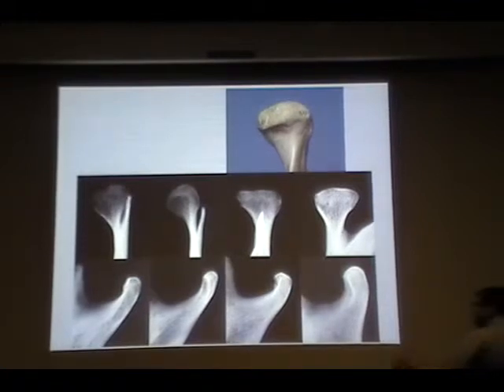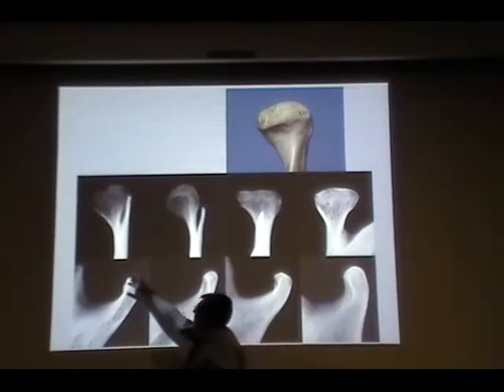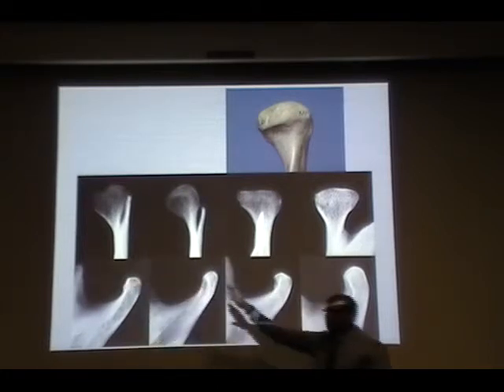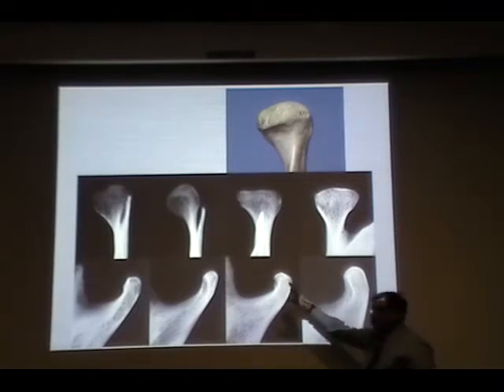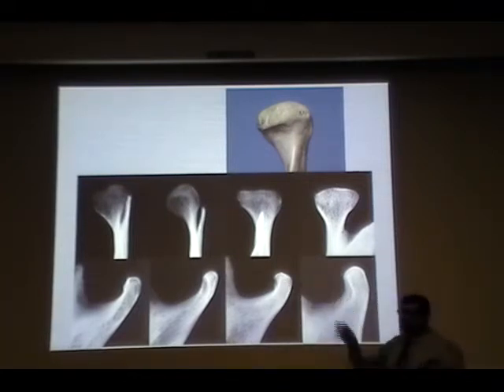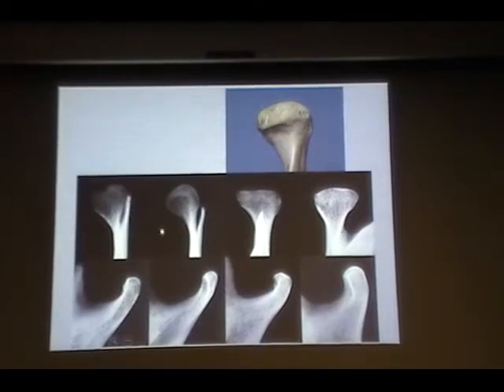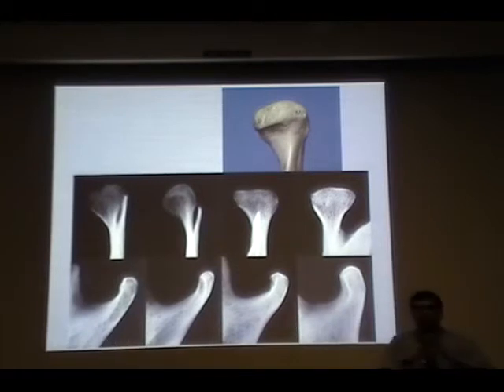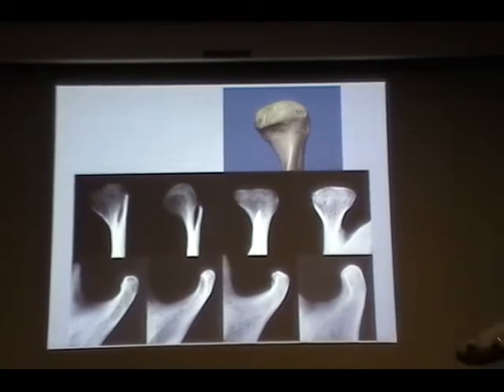Now, these are different structures, or different anatomical variations, that you are going to see of the condyle. So you have the medial pole and lateral pole and pterygoid fovea, but at the same time, what you should know is there could be a variation. Here, it's kind of a little heart shaped. Here, more or less round. It's flat, and the same corresponding images are being displayed in the sagittal view. So that's the anterior posterior view, and this is the sagittal view. Again, you should know the normal anatomy before you call this abnormal.